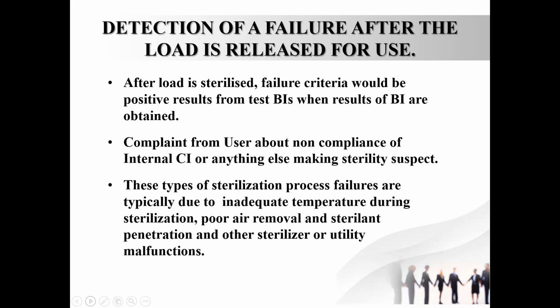This could be because there was not enough temperature in the sterilizer. There was not enough vacuum, leading to poor air removal, and that's why the steam could not penetrate, or utility malfunctions. That means the water or the electricity or the steam was not proper to the sterilizer. That is called utility.